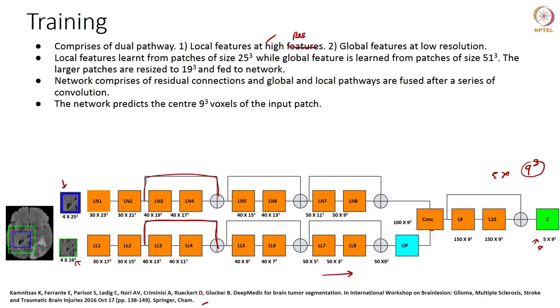So, this architecture was very efficient and it won the challenge 2 years in a row. It incorporates several things. One is that we need 3D context, especially for medical images. That is very important because the images are inherently 3D, so it is good to exploit that. It uses two pathways.